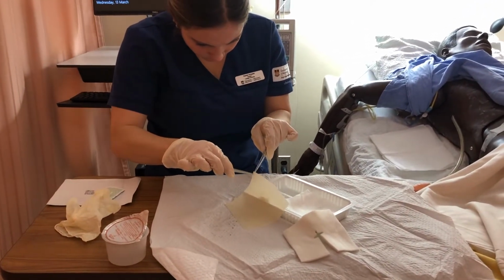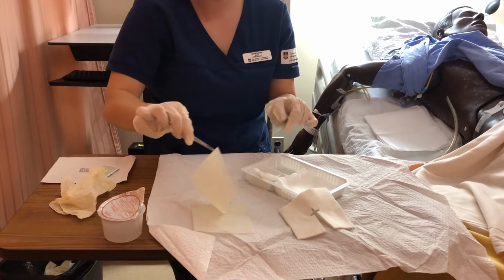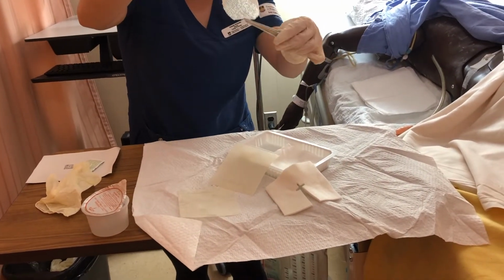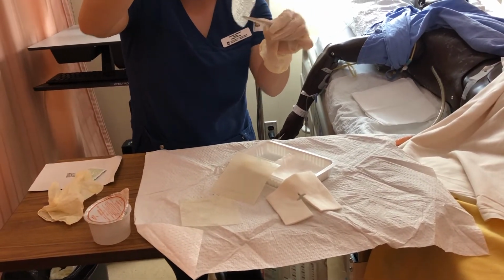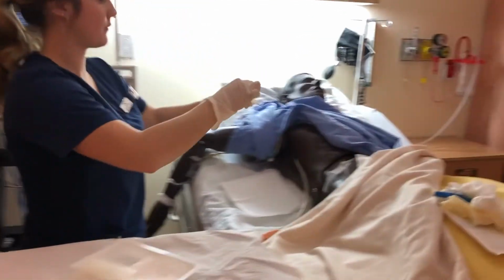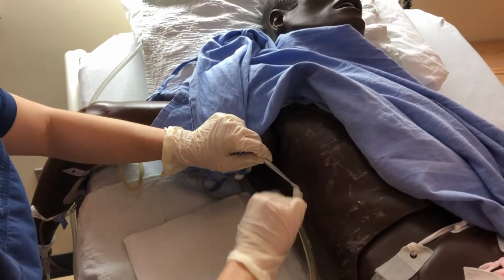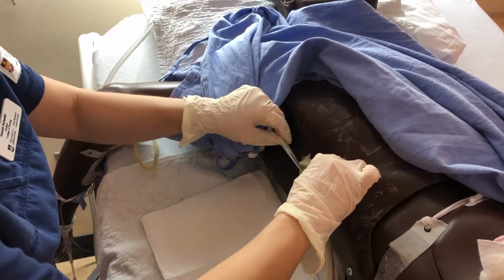Make sure the suction is between 80 to 120. I'll put it at 100. I'm going to check by putting my thumb on. There we go. That's too high. And you want to kind of place it so it's tight enough so that there's no air leaks, but not too tight, and you want it flattened down, just like that.